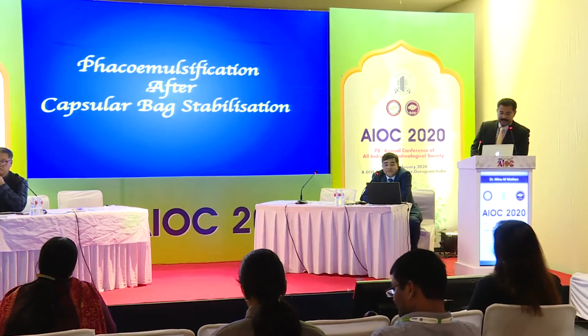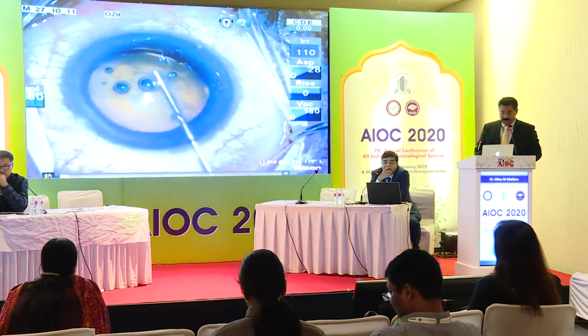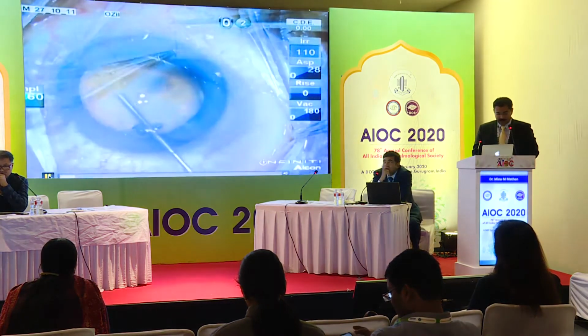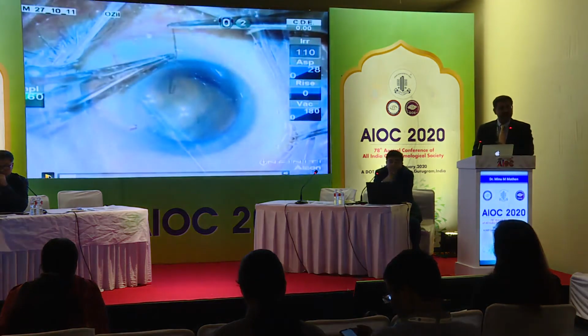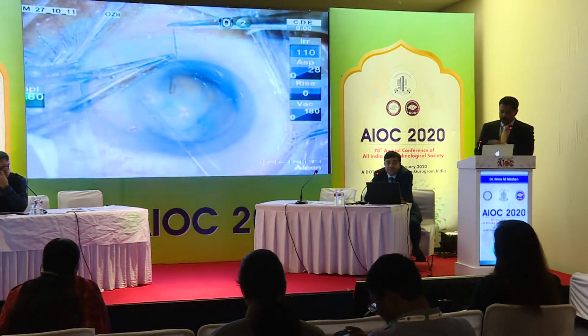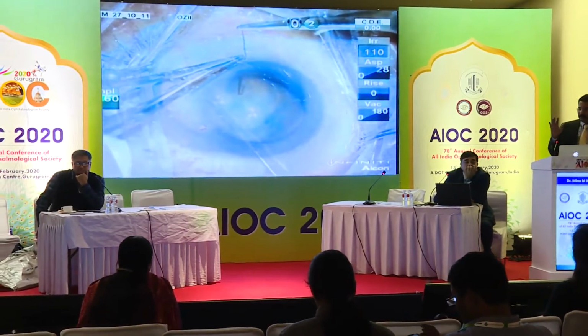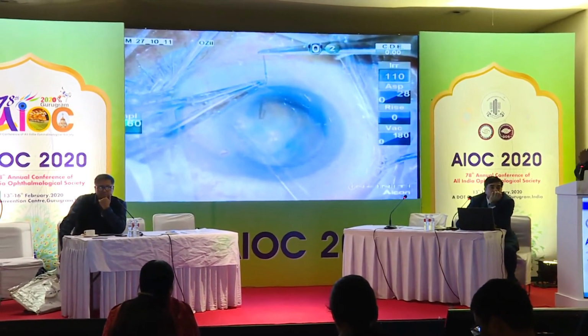Capsule bag stabilization is what is most important. This is one case which came after many years of trauma. On the slit lamp itself, you should identify how many clock hours are involved, and be ready with your armamentarium. But on the table, when you put viscoelastic, you will see that it could be more than that. So please think that there may be more subluxation waiting for you under the iris.